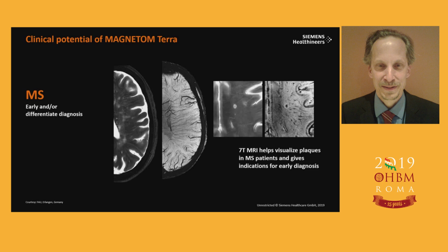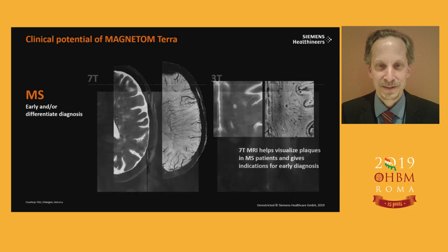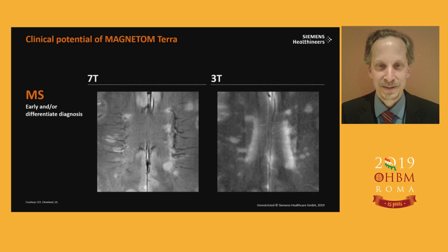And this is interesting because there are already some publications out where it's clearly investigated that if you have a central vein sign surrounded by a dark ring, this is a progressing lesion. And this is obviously a very early lesion, so it has not had enough time to accumulate enough iron that it would become dark, so it's still bright here.